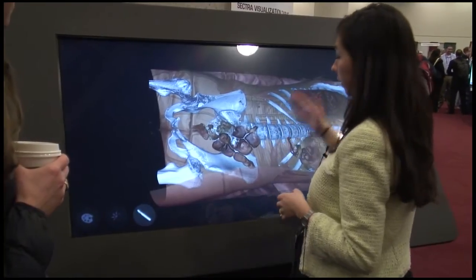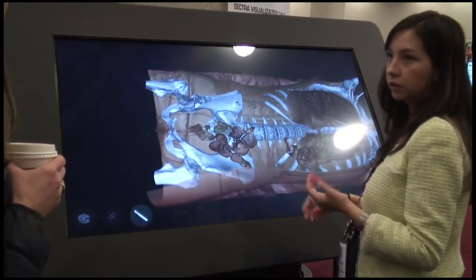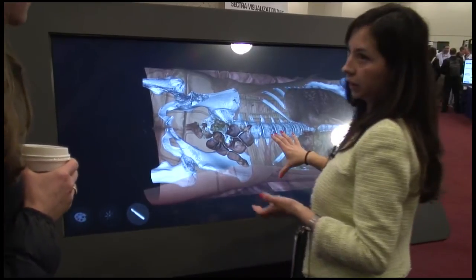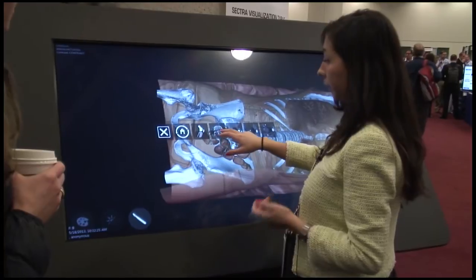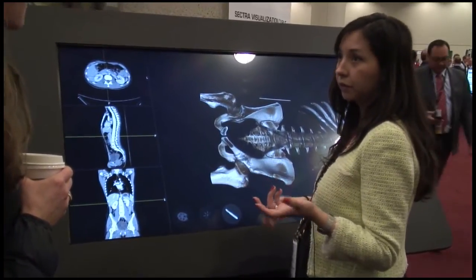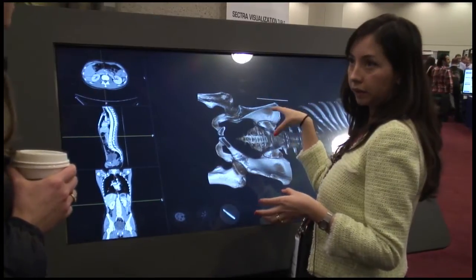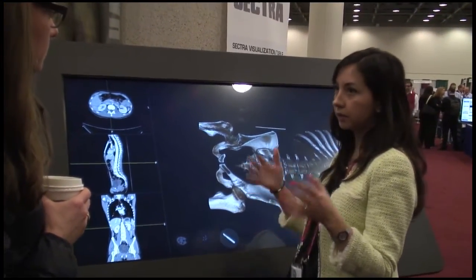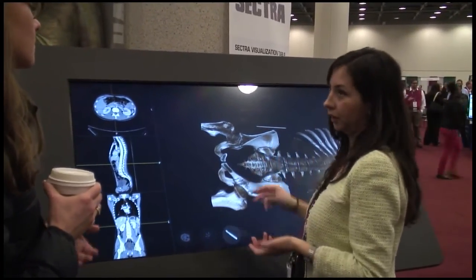The important part of the system is that you can import any DICOM data — CT, MR — and it depends of course on the quality of the scans as to how you will see it here. We can connect it directly to the PACS of the hospital, so all the cases pass here automatically, or we can even create filters — for example, just the pelvis studies pass here but not the brain or the heart.